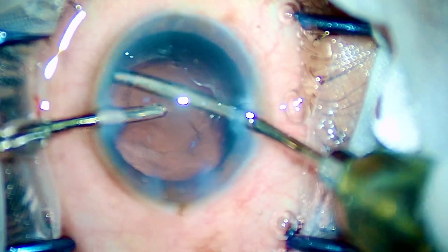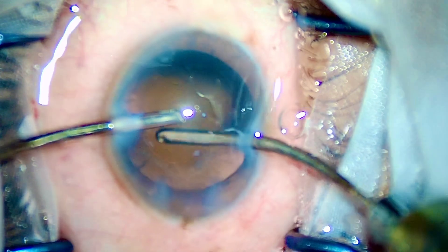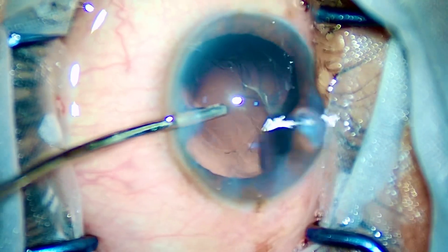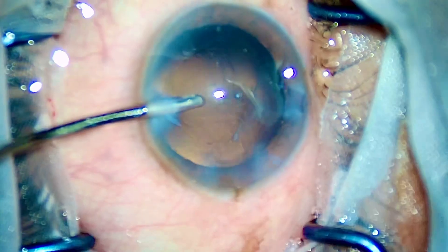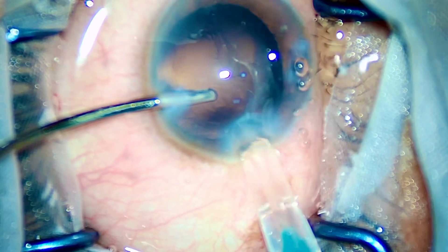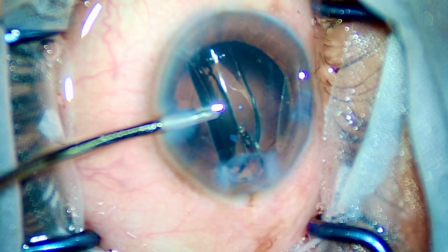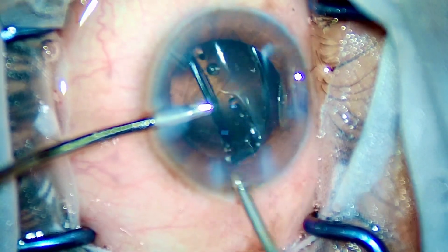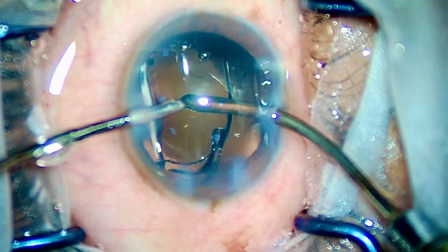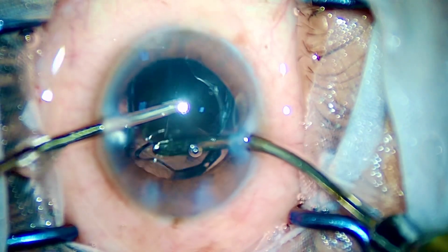One should always make a rhexis that is beautifully centered and completely circular, using optimal amounts of shearing and tearing forces, those beautiful bi-planar or tri-planar incisions, those perfect side ports in the perfect plane, and yes — at the end, beautiful centration of the IOL.